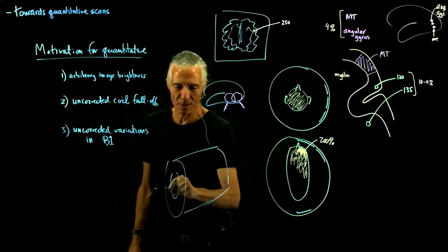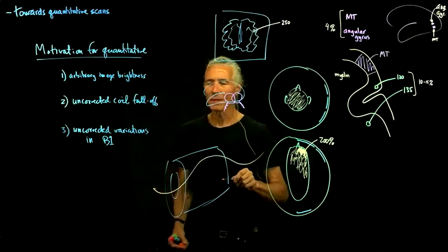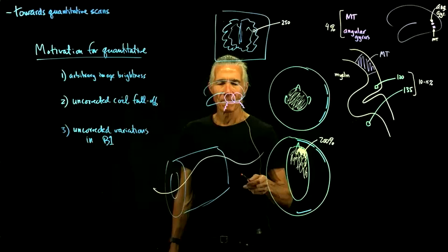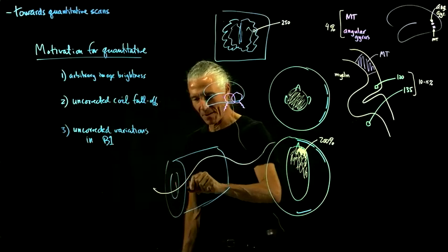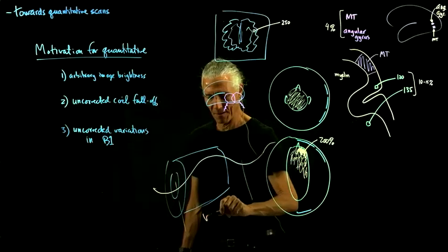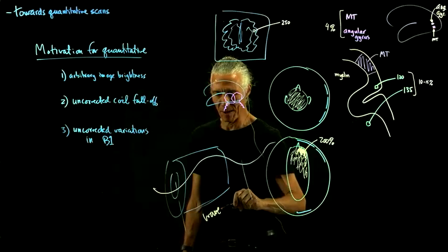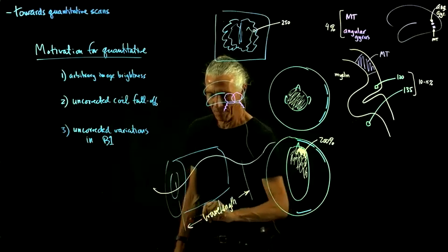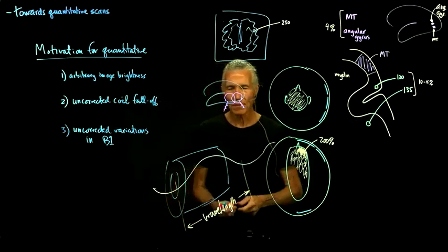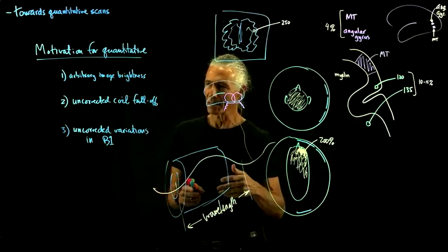The wavelength is going to be quite big, something like an FM radio station. So this is the wavelength here of those radio frequency waves. It's a little bit bigger than that, but it's like a meter or something like that.